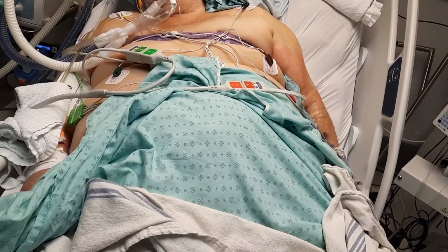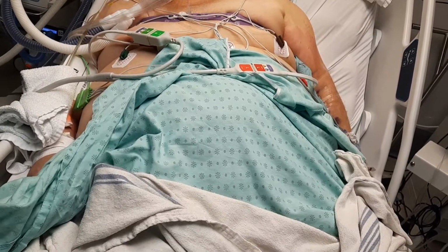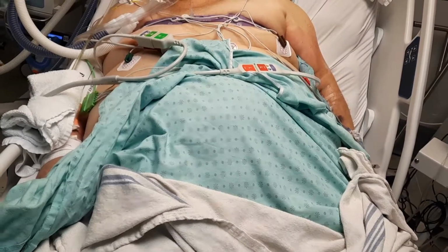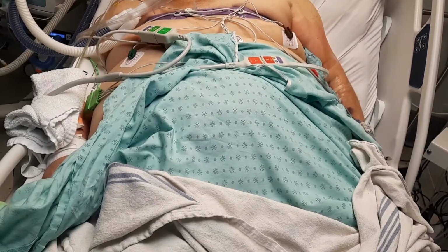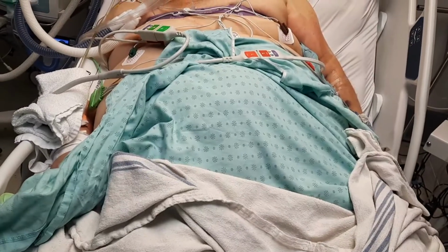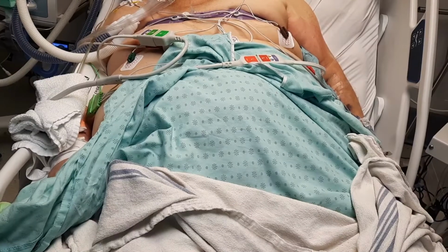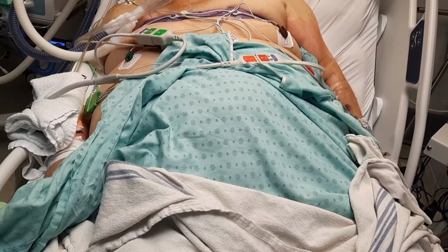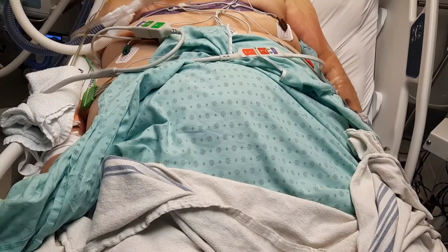Morbid obesity, over 400-pound patient, intubated, installation of the PulmoVista, the electrical impedance tomography, currently on AC VC, had a PEEP set at 10. We did a PEEP trial from 10 up to 20, and we're going to verify and see the results of the PEEP trial.